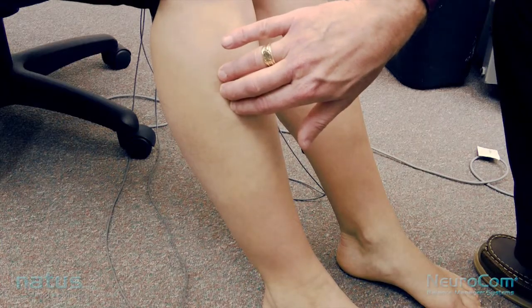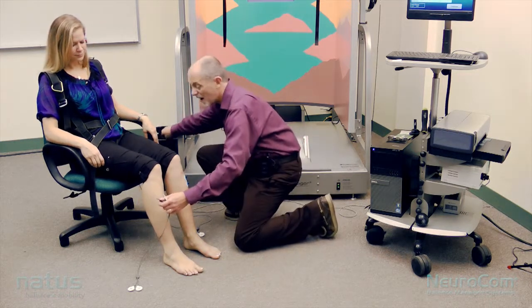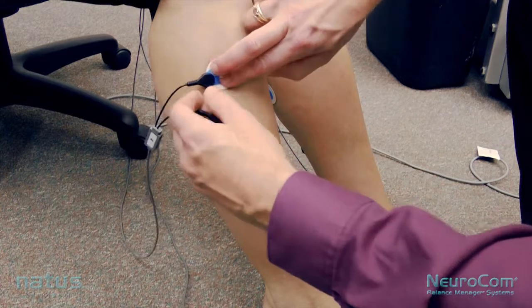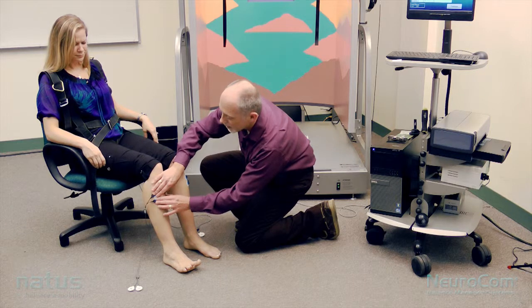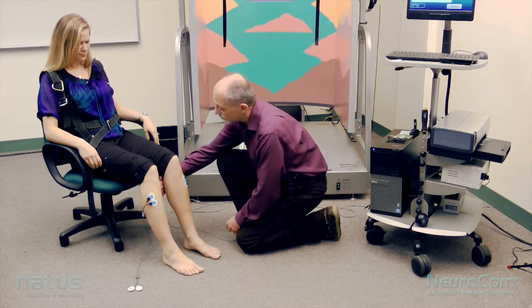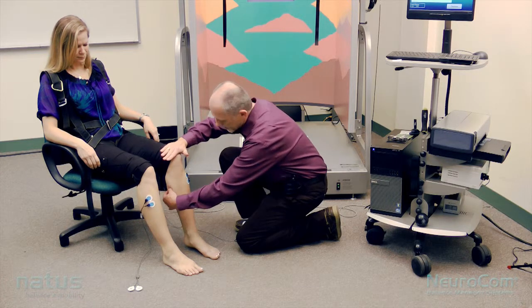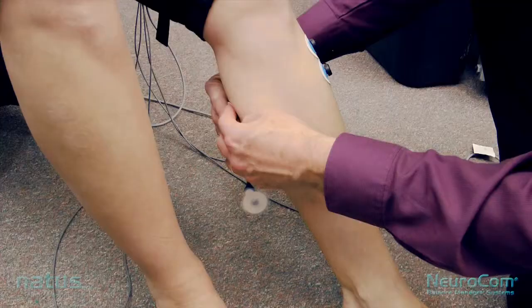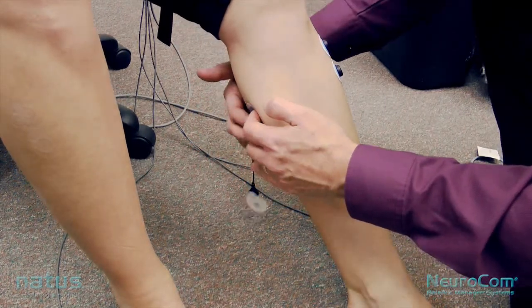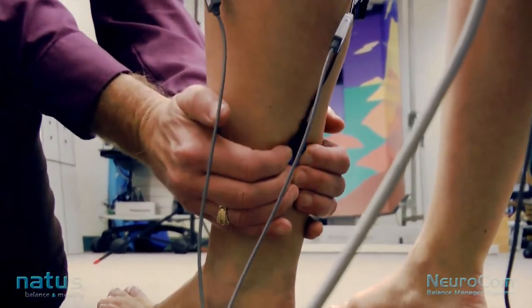Like all surface electrode recordings, the longer these electrodes sit on the skin, the better the impedance. If you're going to perform your core test battery on the dynamic platform and you know ahead of time that you're going to be doing the PER test, it's very helpful to put the electrodes on before you perform the computerized dynamic posturography test. That way the electrodes settle down very nicely by the time you get to do the PER after that. Five fingers down from the back of the knee to find the position for the gastroc electrode. This little reference electrode should be set down as far as possible onto bone.